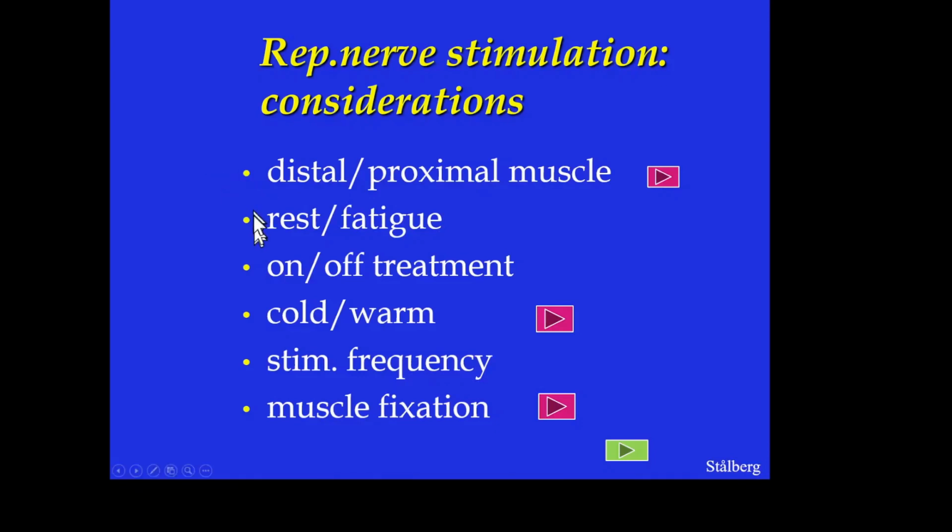So there we recommend, if you want to make follow-up in a detailed way, to have the patient resting for 15 minutes before you start the test.